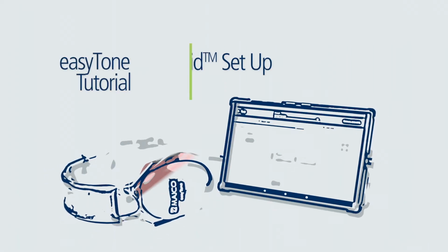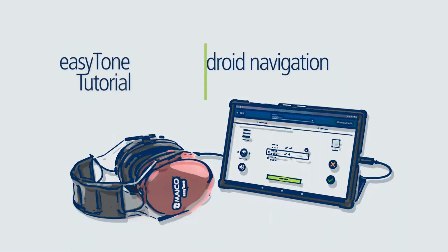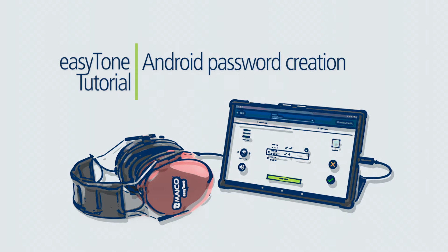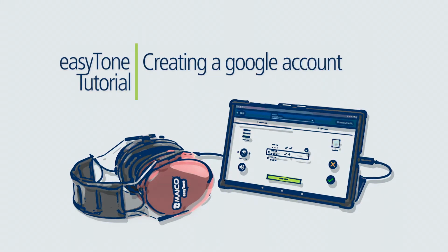This tutorial is to show you the Android device setup functions for optimal performance of the easyTone audiometer. The items to be reviewed include basic Android navigation, Android settings to customize performance, Android password creation, connection to Wi-Fi, and creating a Google account.